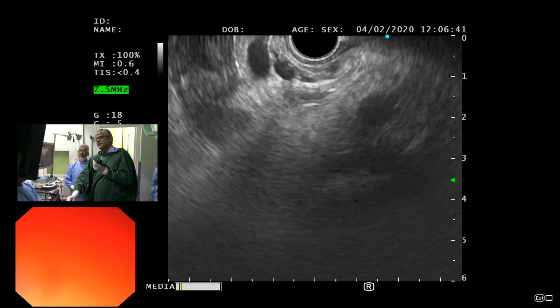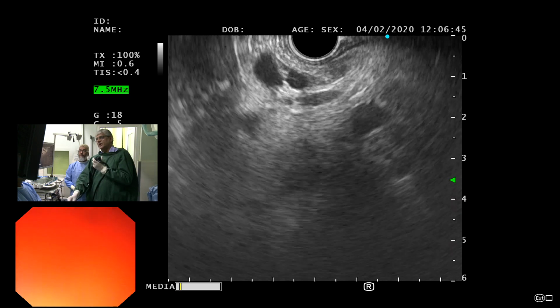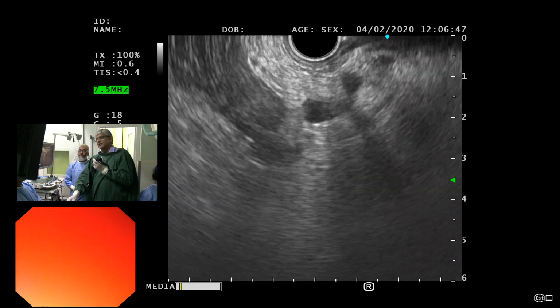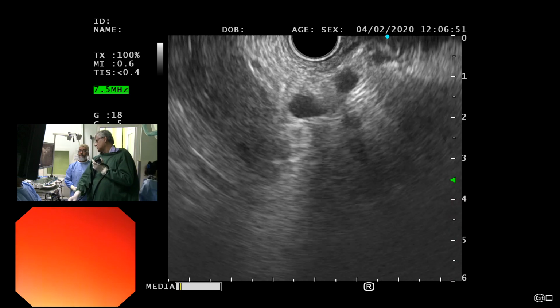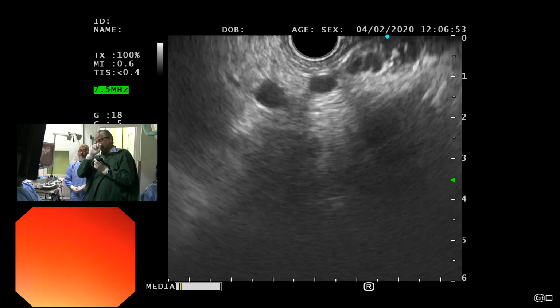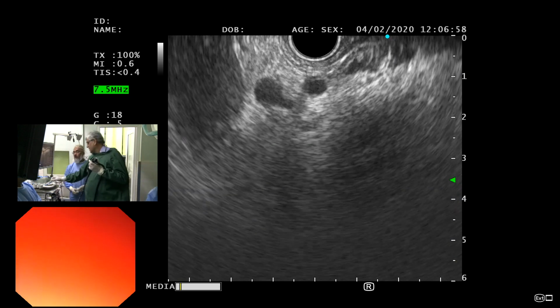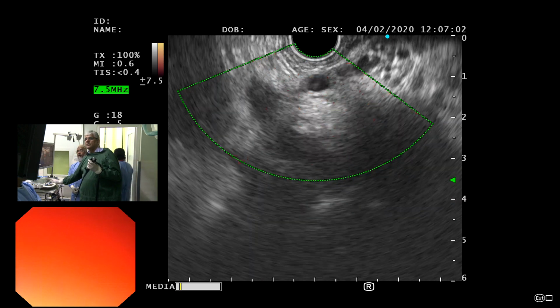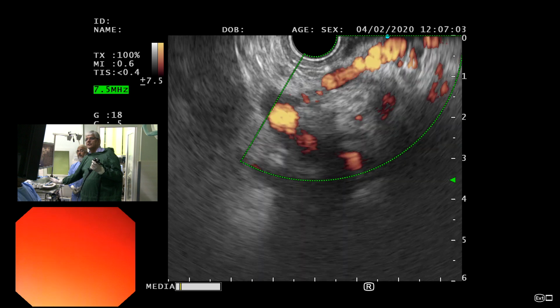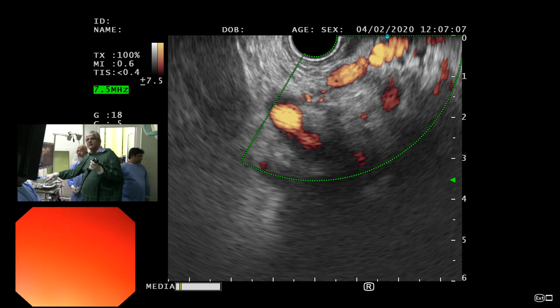I'm just gently letting the big wheel away a little bit, going in. And you have complete atrophy of the tail, so you're not seeing any tail. The thing that you normally see here, we are not going to see. There are some varices, I think. See, these are varices there, and this is probably from the pancreatitis she's had.